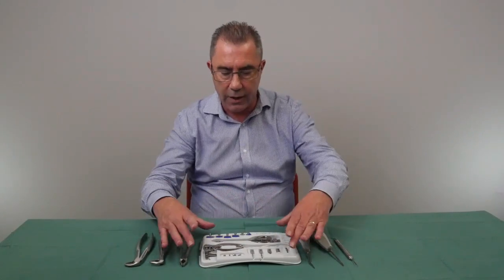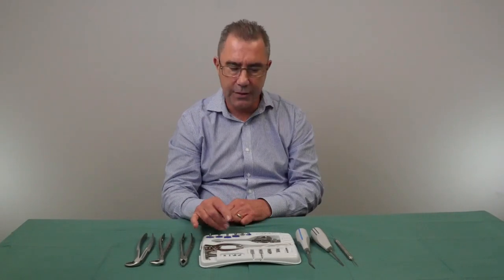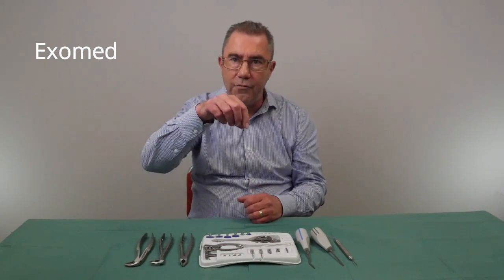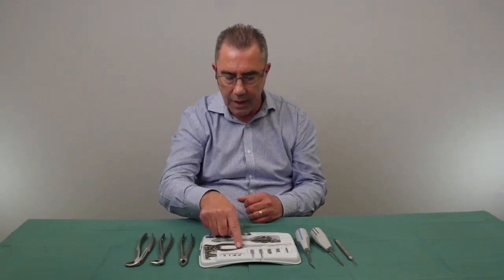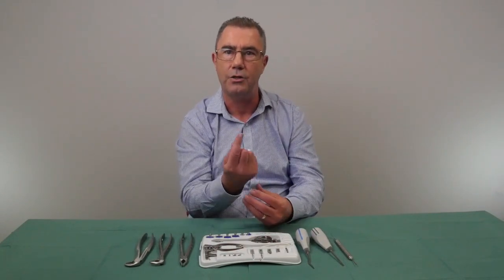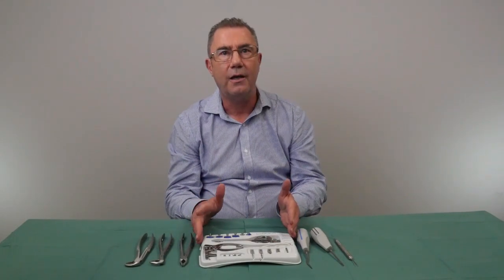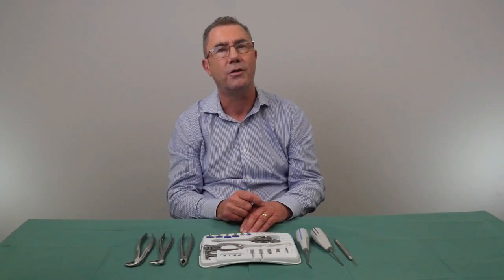The next instrument I want to talk about is something called an ExoMed. This is a device that uses a principle similar to a pulley used to lift an engine out of a car. You have a screw that engages into the root of the tooth, and then a pulley system and winding device that enables you to apply vertical pressure to pull the root atraumatically out of the socket. There will be a link at the end of the video to find out more about items like the ExoMed.